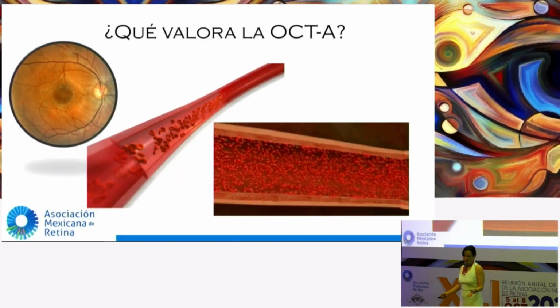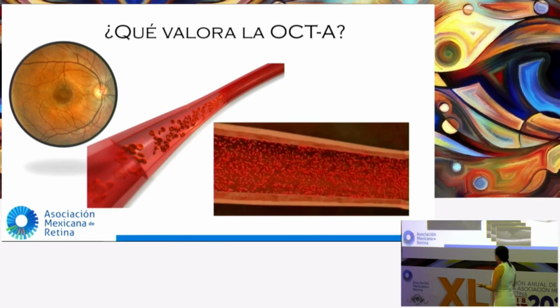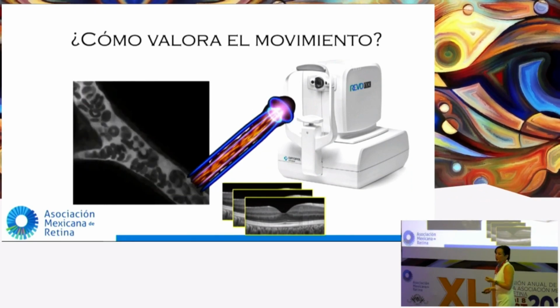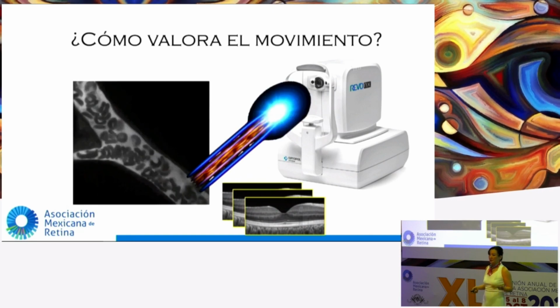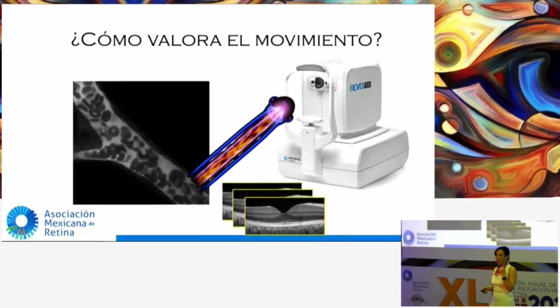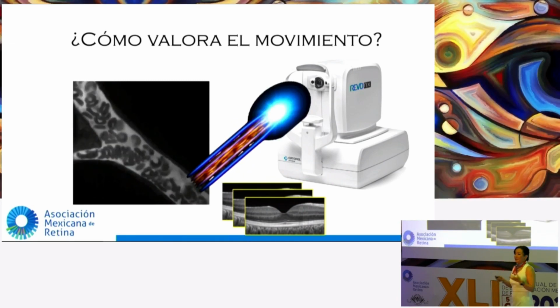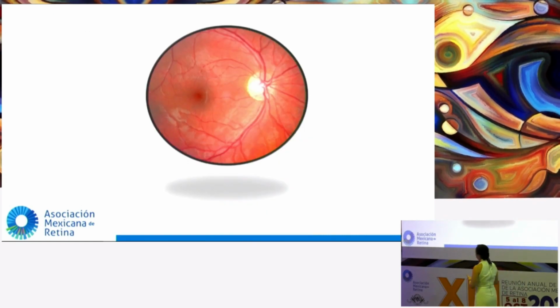This assesses motion, movement of erythrocytes. And how does it do so? I say that this is through repetitive horizontal and vertical slices that are correlated to bring about a three-dimensional image on a coronal field. Maybe I didn't say much, or I was not too innovative in my explanation, but let's break this down to the detail.